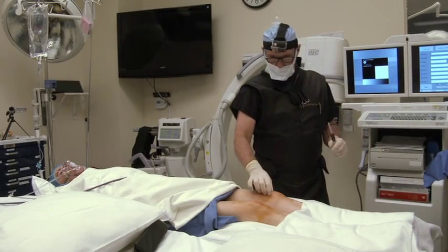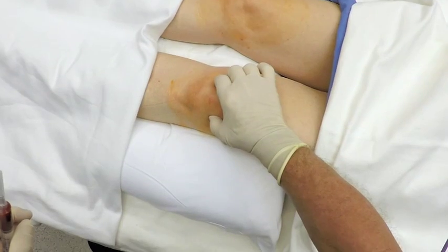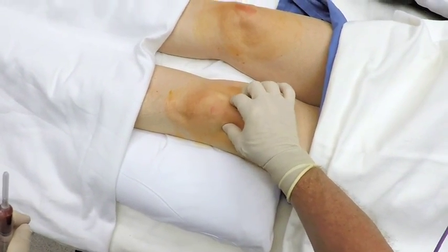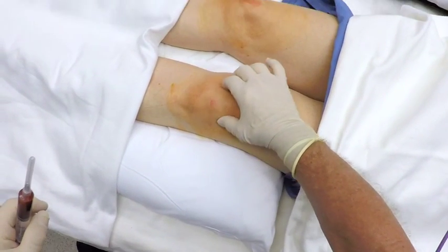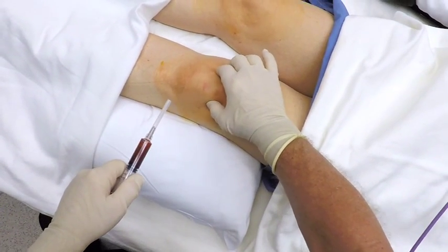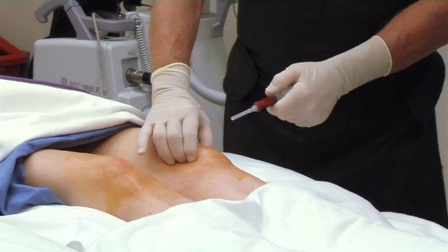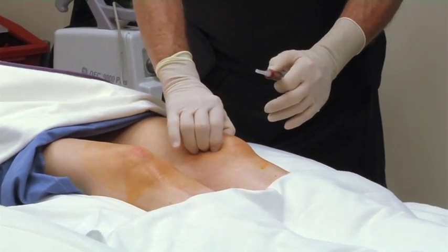What we use for landmarks in knee injections is the patella. The best place to inject is either medial or lateral to the patella. The needle is inserted in the top half of the patella, goes under the patella and into the joint.